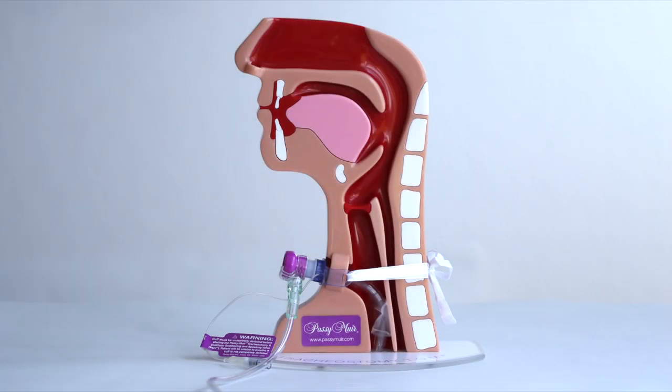The Passy Muir PMA Oxygen Adapter is designed for short-term use with low-flow oxygen. It can be used with the PMV-2000 Clear and PMV-2001 Purple valves.